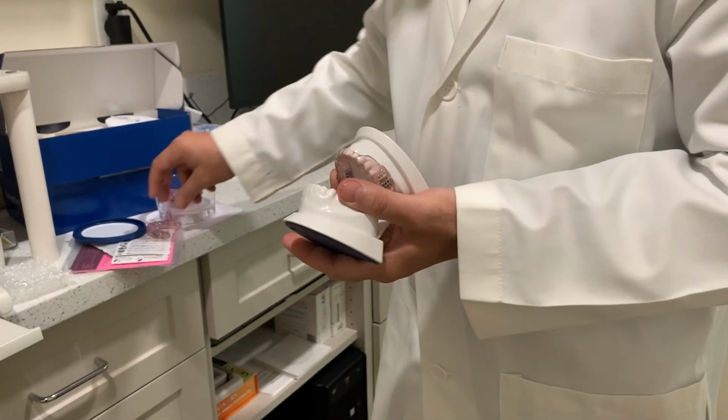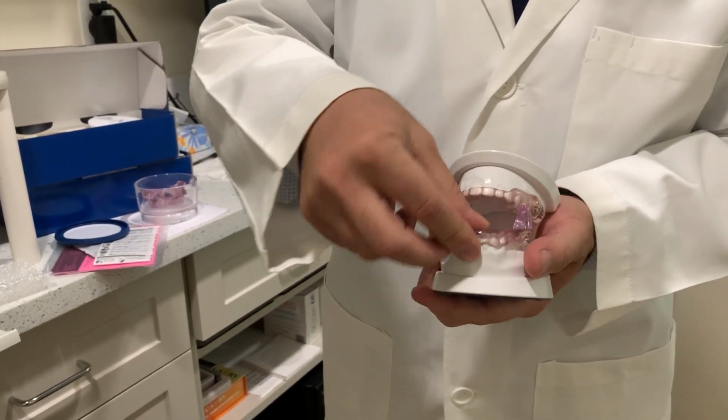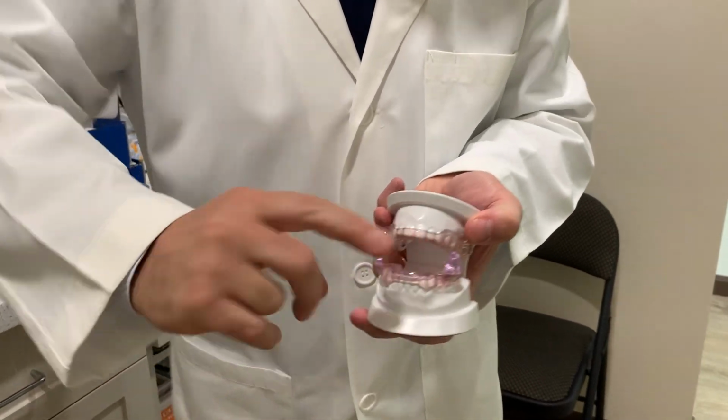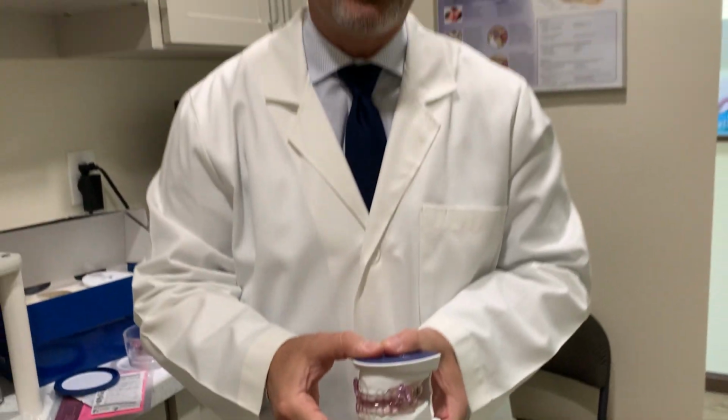Then you put in the lower front teeth first. And with your index, you'll be putting it back and pushing it down. So I'm just going to do it that way, pushing it in place and then biting it in.